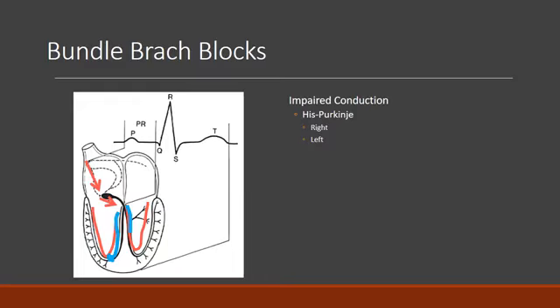Here you can see that the blockage is on the right-hand side and the left is working normally, or we can see the opposite, where we see a blockage on the left-hand side, and so the right is able to depolarize normally.